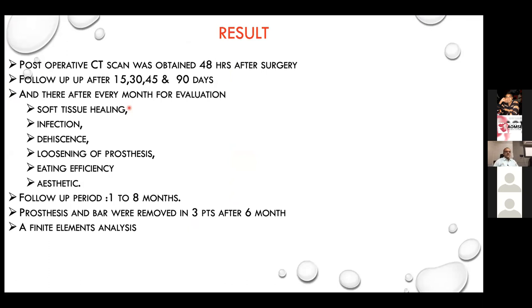So every patient has undergone a CT scan after 48 hours. And at 15, 30, 45, and 90 days, we did a follow-up for any dehiscence, infection, loosening of the prosthesis, chewing efficiency, and aesthetics. The usual follow-up right now is 1 to 8 months. And in 3 patients, actually, we removed the prosthesis to see how the condition is below the mucosa.